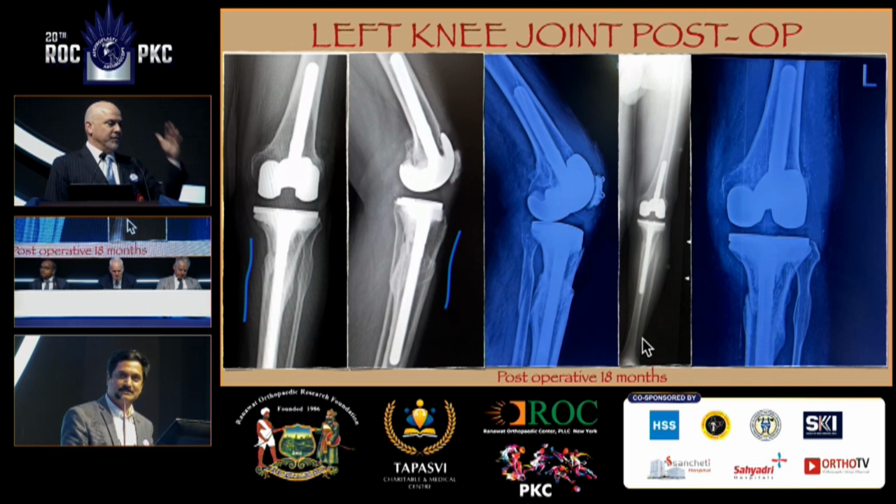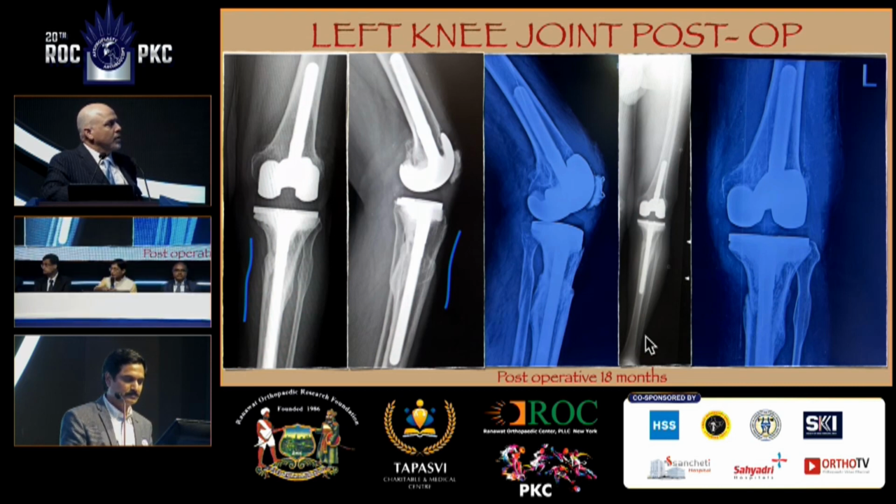You know, if it was a vertical fracture patella, you could probably get away with leaving it or using, as you said, sutures. If you go to Arthrex and some of the other sports companies, they have really robust sutures and fiber tapes and fiber wires that can hold bones together. But the wire's not there in the X-ray on the left, the lateral view. So did you go and take it out later? Yeah, we have taken it out.